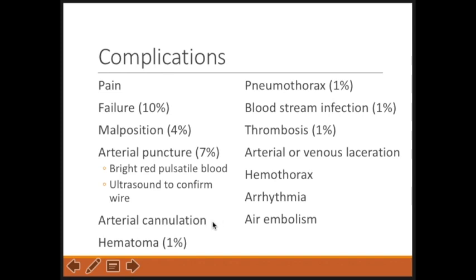If, unfortunately, you've dilated the artery or threaded your catheter into the artery and caused a larger hole in the carotid or femoral artery, then you have to call vascular surgery prior to removal. The vascular surgeons may take the patient to the OR and remove it in that sterile setting in case they have to emergently open up the area, explore it, and potentially sew it back together.